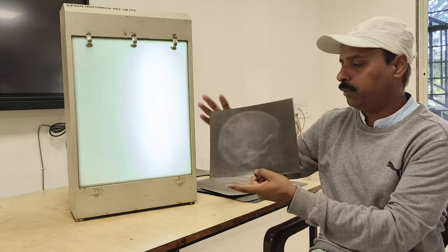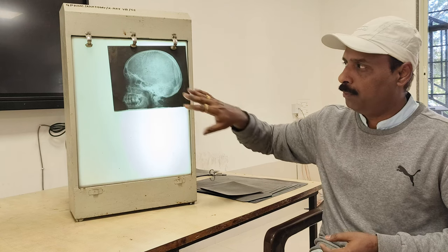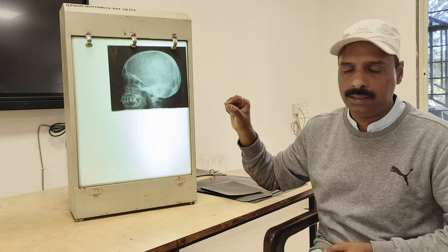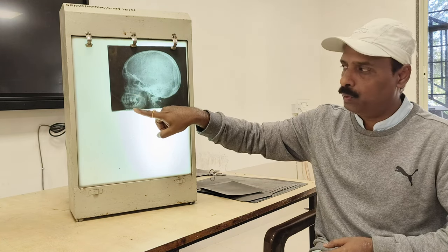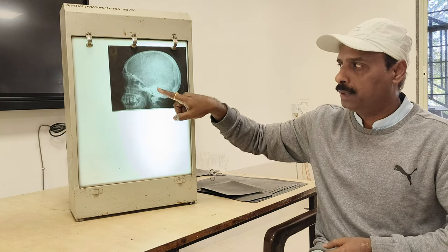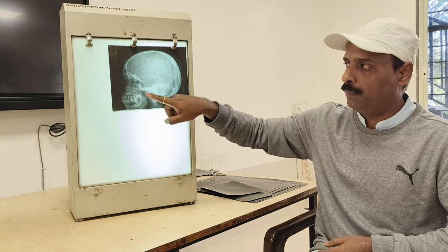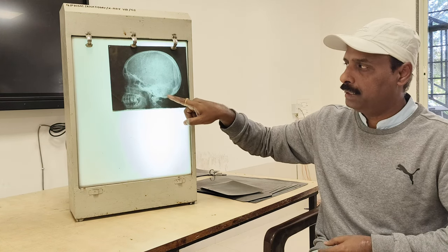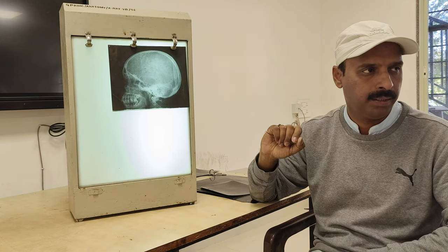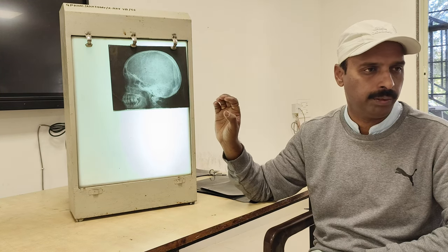Then this is also the same one you can remember when reading the skull. The skull bones we get: you see all the cranium, upper jaw and lower jaw, like maxilla and mandible, and here we have the cervical spine. You have to see these sinuses: frontal sinuses and maxillary sinuses, and this is the outline of the cranium. So it is also a plain x-ray of the skull, lateral view, and you have to explain the different bony parts.